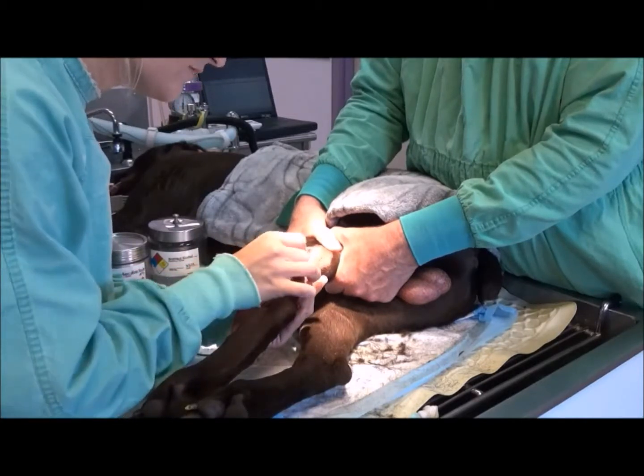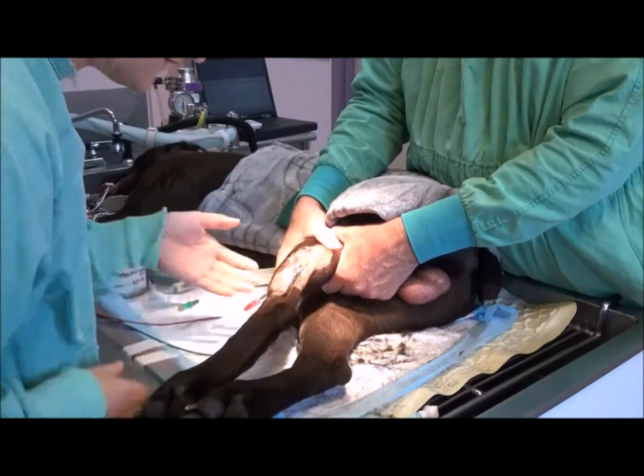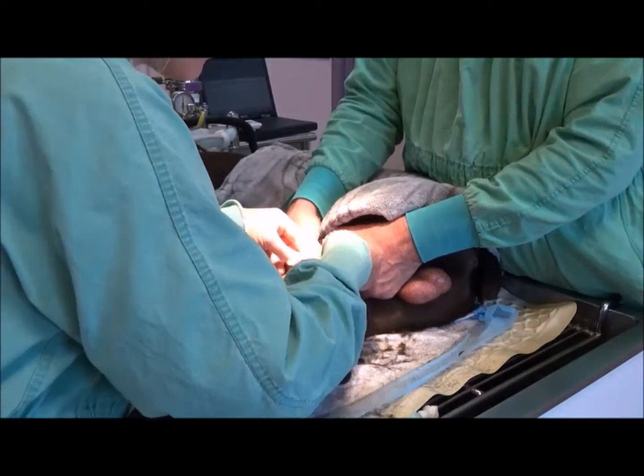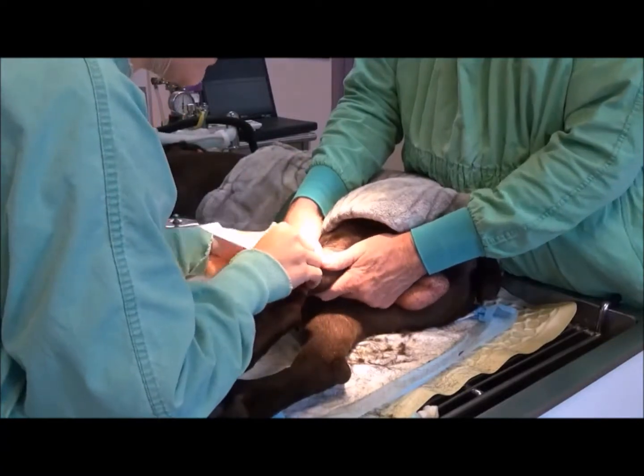Make sure you see my flash of blood, which I do. Fully insert the catheter, and then go ahead and place your tape around the catheter. Make sure you do it snugly.